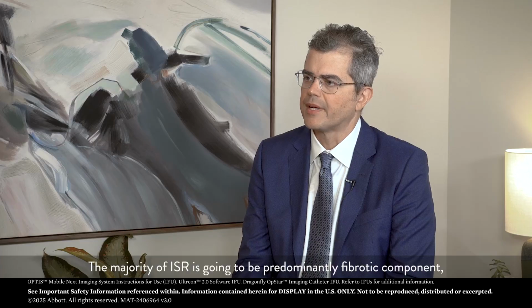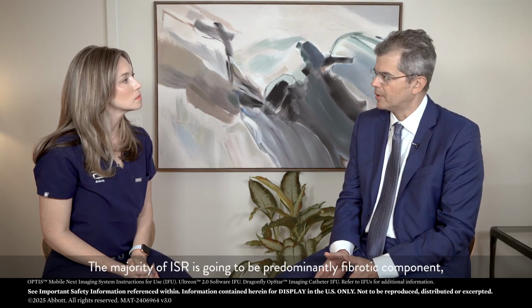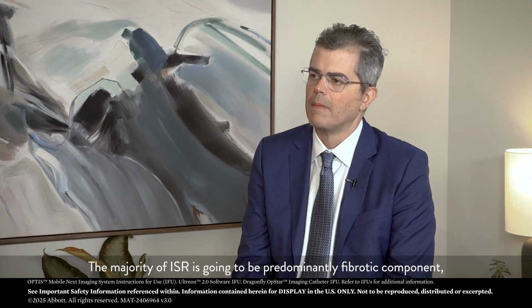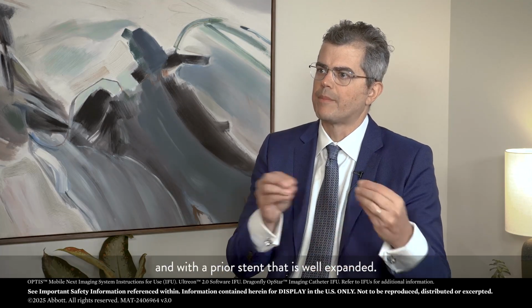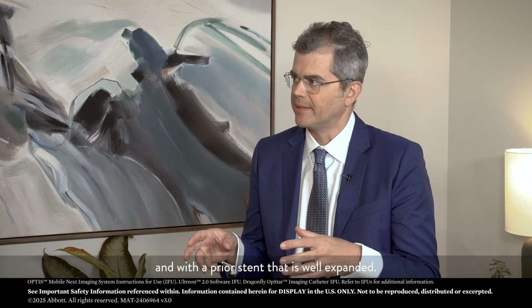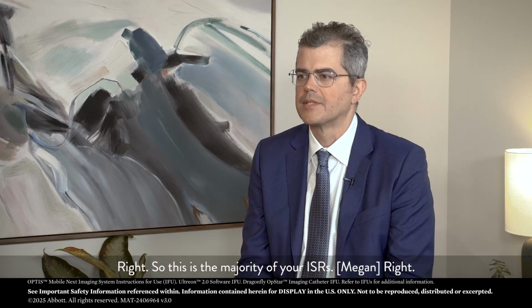The majority of ISR is going to be predominantly fibrotic component, and with a prior stent that is well expanded, right? So this is the majority of your ISRs.